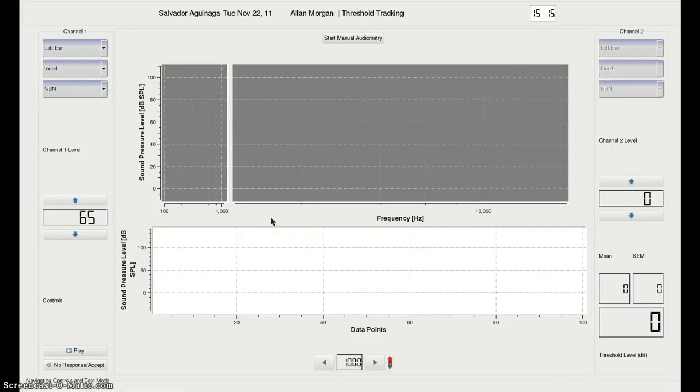Okay, this is part three of the tutorial series of the new Harp Strings windows. This is the Threshold Tracking window. This is called the Hybrid window.